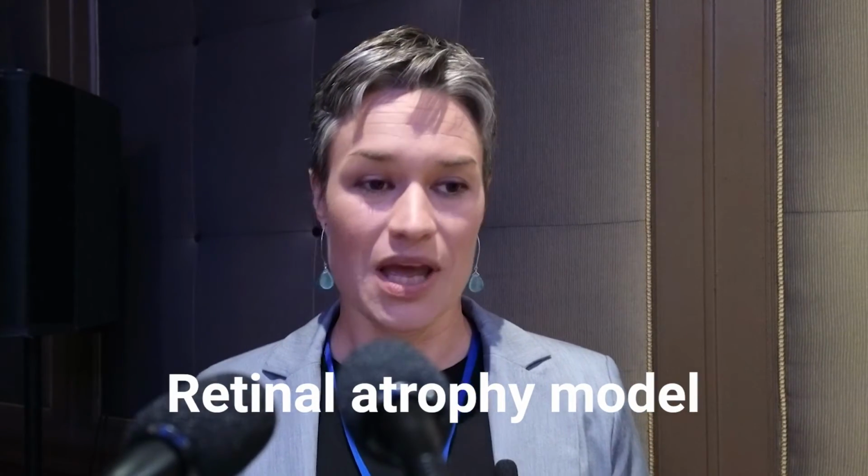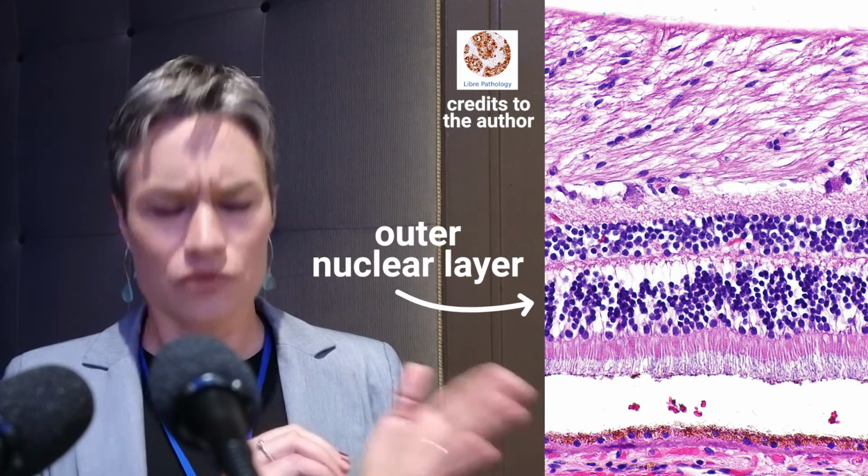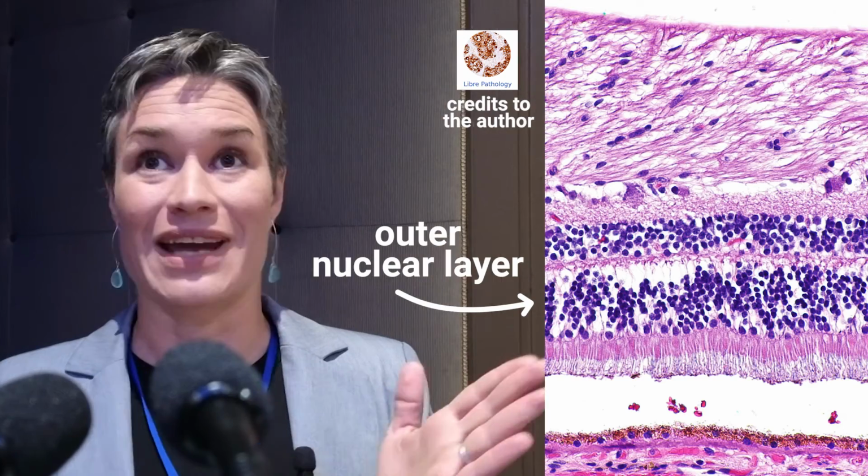You can end up with a lot more difference than you need by everybody annotating things correctly, but not really in the way that is good for the validation. So we developed a retinal atrophy model, where in the retina you have a nuclear layer, the outer nuclear layer, which has a lot of nuclei, right? And we would do object counting for this.